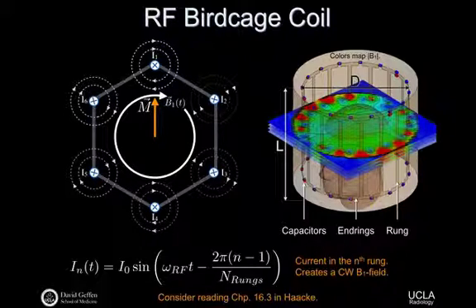So that gets into the design of the B1 field itself. We'll see this some today, but the B1 field, we can turn it on, turn it off. We can also modulate that so that the I0 function here could itself be a function of time. When transmitting the B1 field, it doesn't turn off.